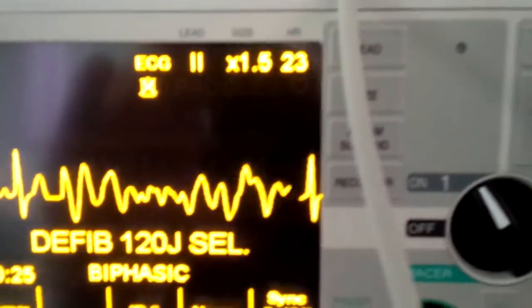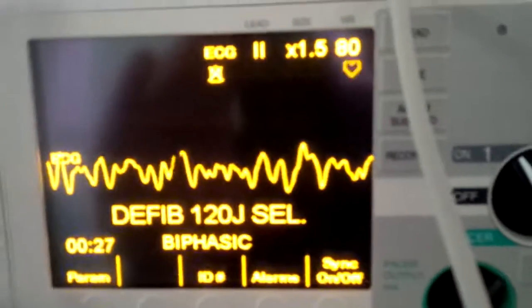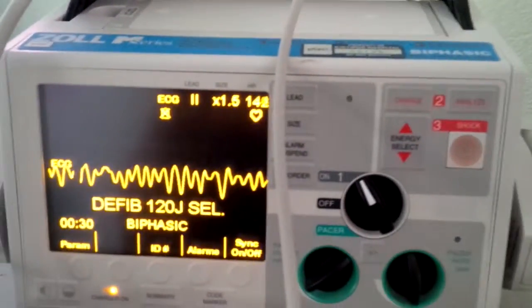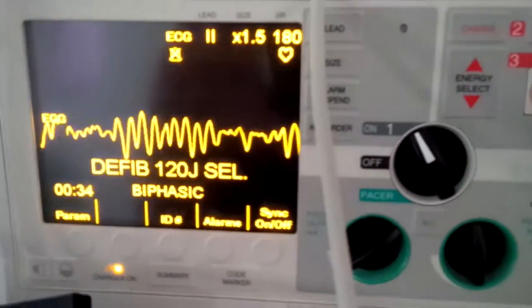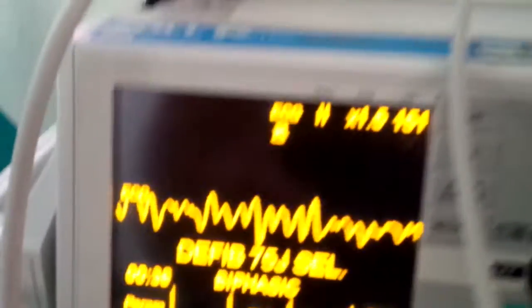It's VF. So now the standard test setting on this one is 30 watt seconds. So that's what we're going to — energy select down to 30. Then what will happen next is we will charge.